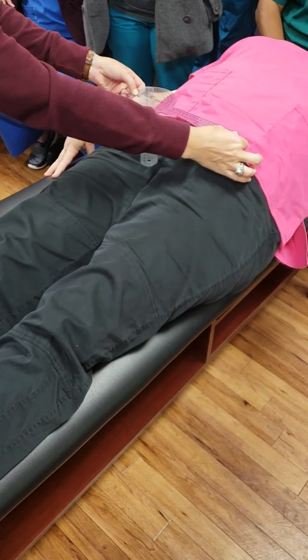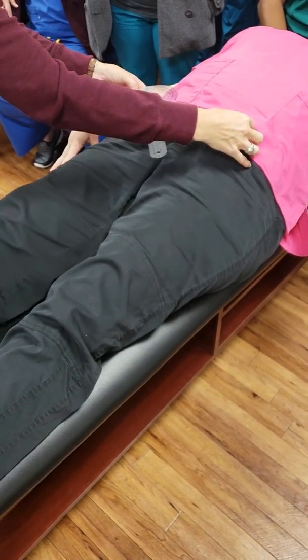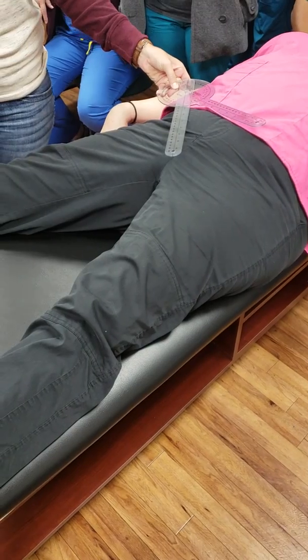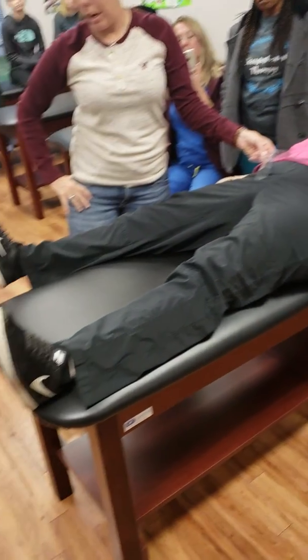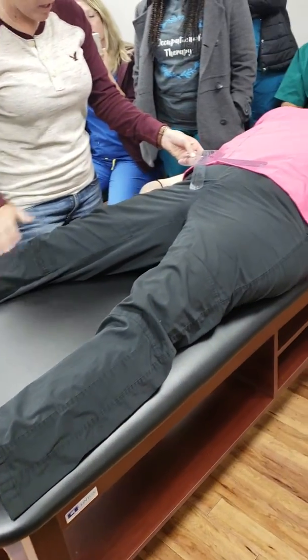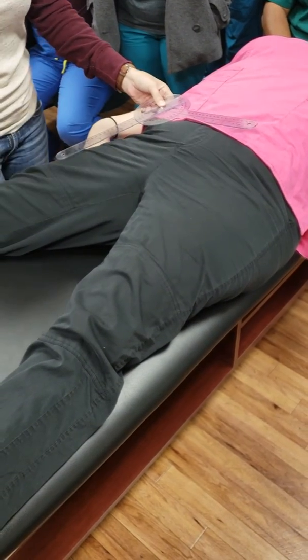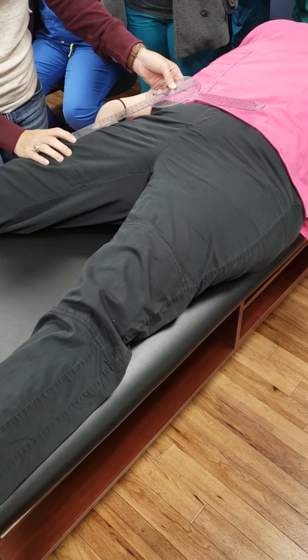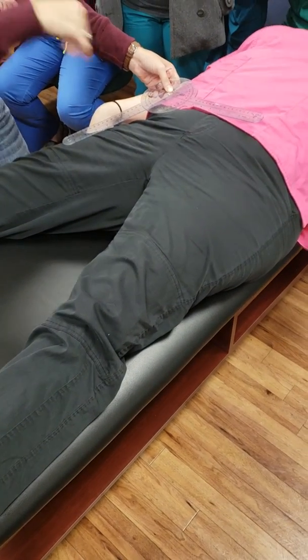Sometimes it may shift down. It's not going to be directly horizontal. So when she brings her leg out, make sure the toes stay up, because if you rotate the toes outward, you can get more abduction because you're externally rotating and compensating in the hip. So make sure that she stays with the toes towards the ceiling. Your movable is going to be the midline of the femur on the anterior aspect.